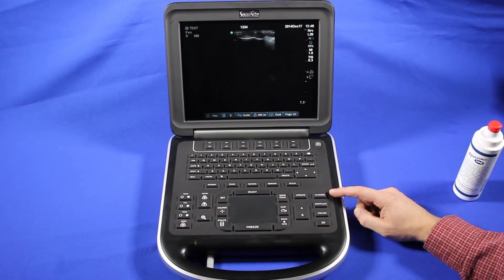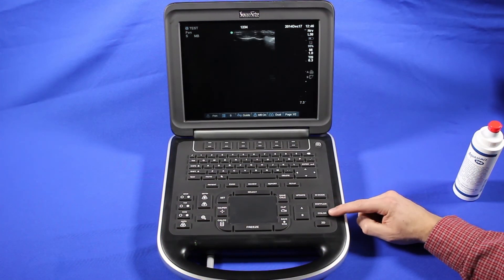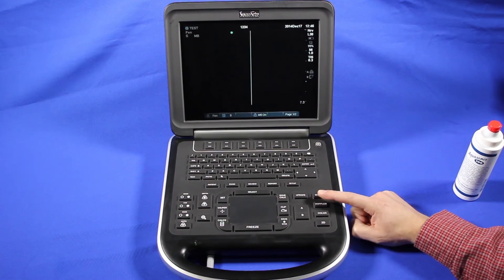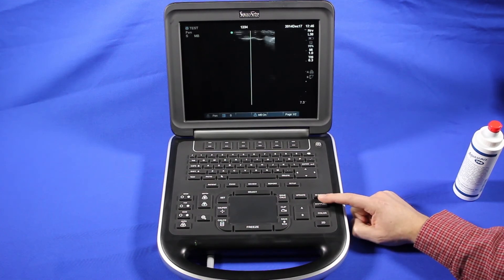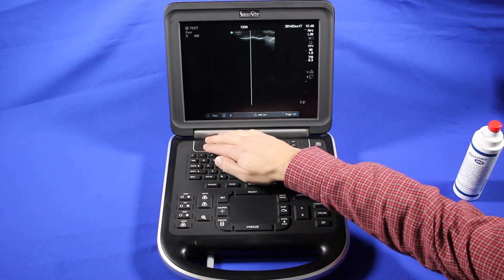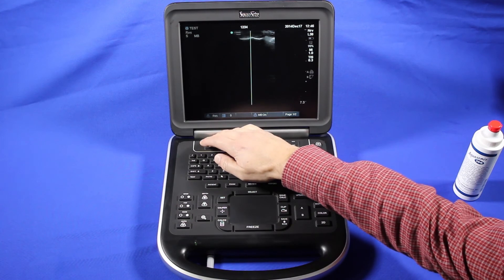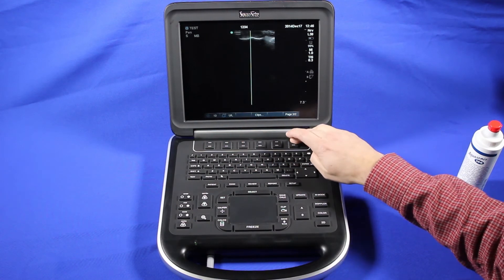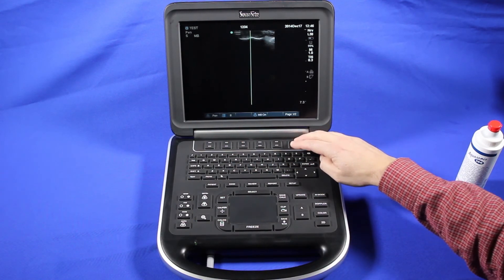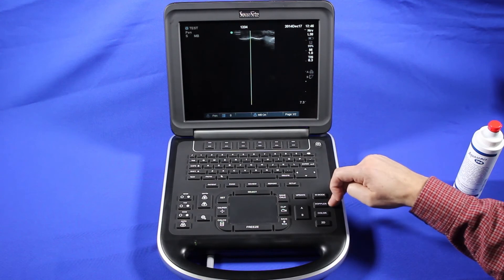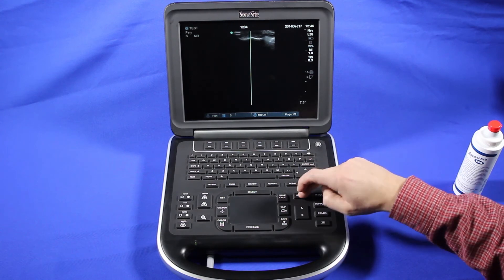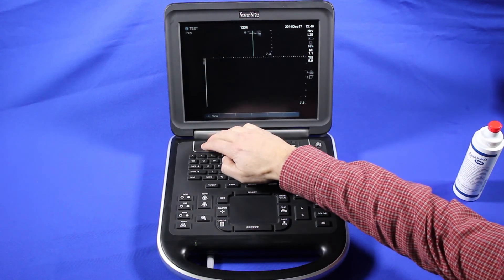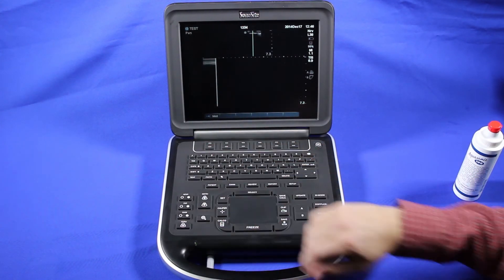Next we'll get into the Doppler and color Doppler modes. We'll show M mode real quick. You can set the image optimization or your dynamic range, and SONO MB. When you're ready to go into M mode, you're going to click update. And you can change your sweep speed here.